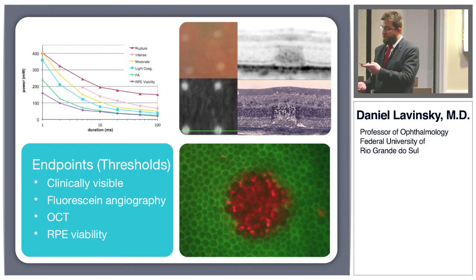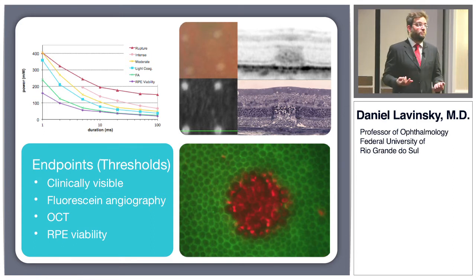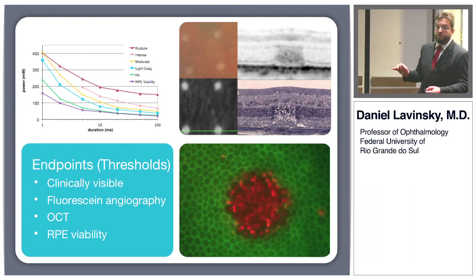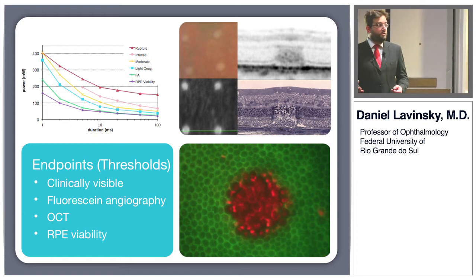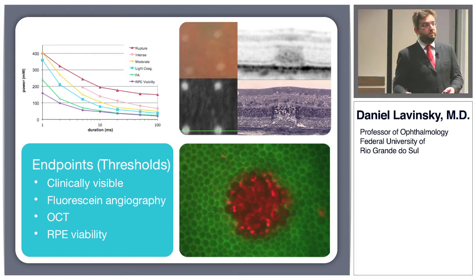So we have different thresholds. What's a threshold? The threshold could be the clinically visible threshold. This is usually what people call subthreshold. If they do see the burn, that's threshold. If they don't see the burn clinically, that's usually what they call subthreshold.